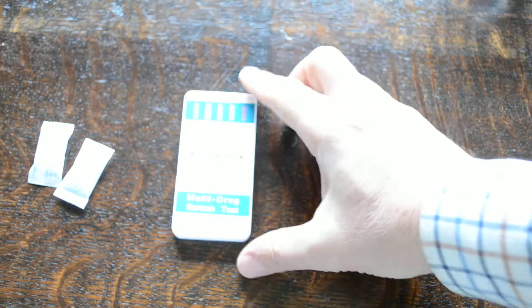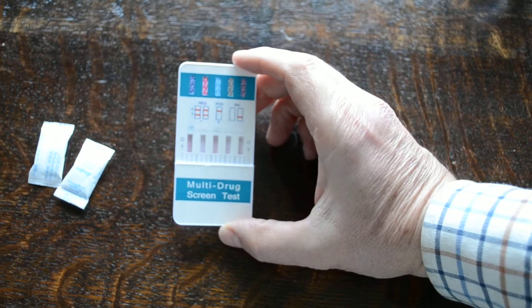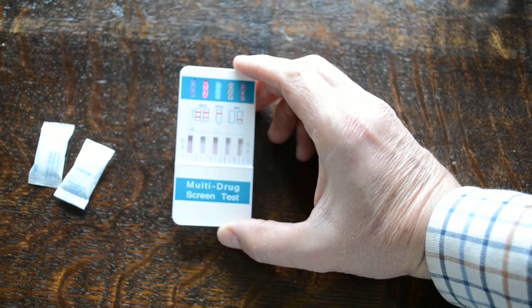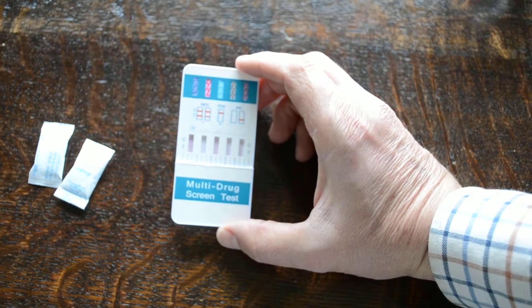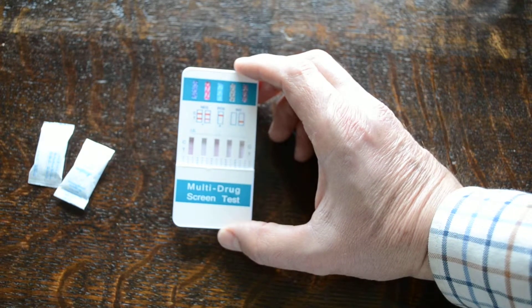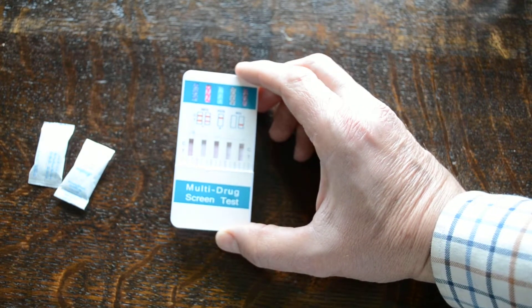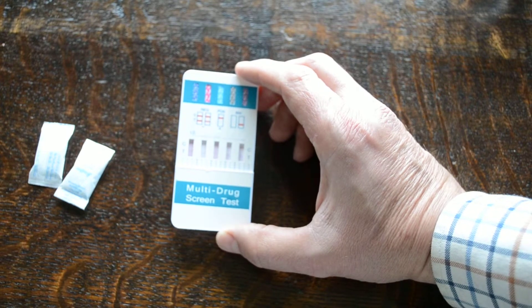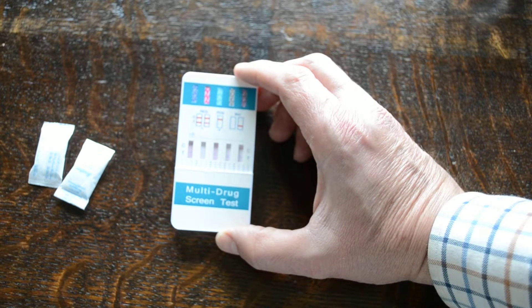Now this is a standard format for drug screening whereby you're basically looking for a control line to form on every test membrane to confirm that sufficient sample's been added and absorbed by that membrane. Then you're looking for the presence or absence of a test line to indicate the presence or absence of the drug.